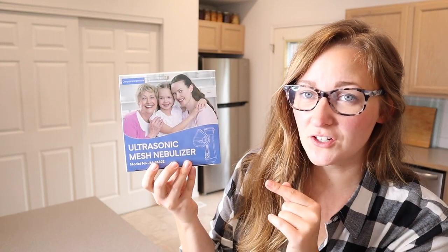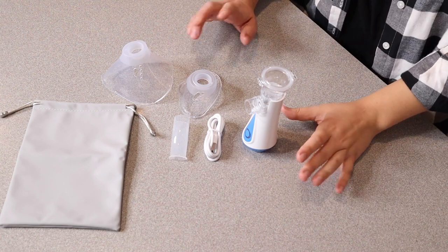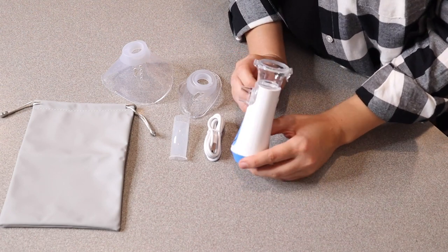Right here I have this portable nebulizer. I'm going to open this up and show you everything it comes with. So you can see everything that came inside the package besides the user manual. We have the actual nebulizer itself right here.